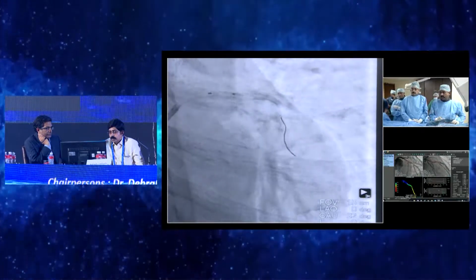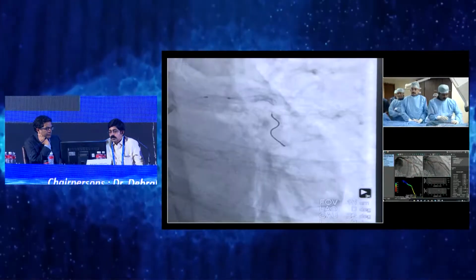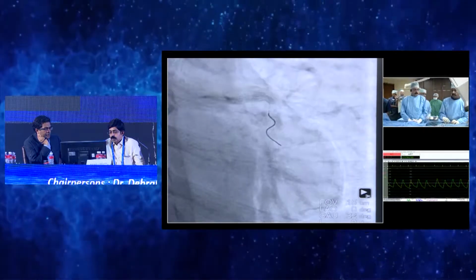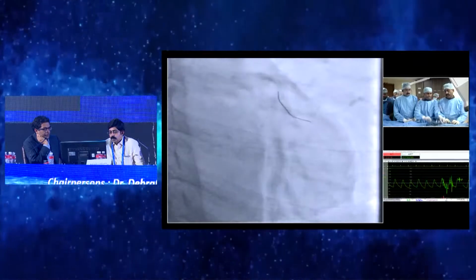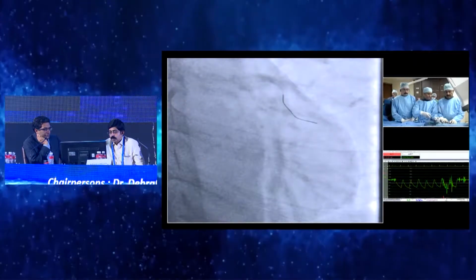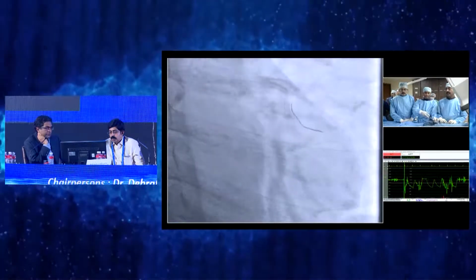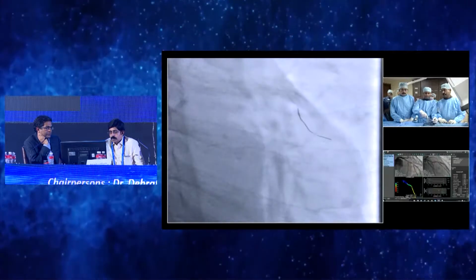Then proximally we were careful not to come out of the stent and dilate. It gave more pressure in the proximal portion. So we will show the final picture that we have now. We didn't take a picture? No, we didn't. Okay, so we'll show you the picture now. That's where we are. After this our plan is to go to the LCX and stent it, and then finally we will do RCA, QFR and FFR.